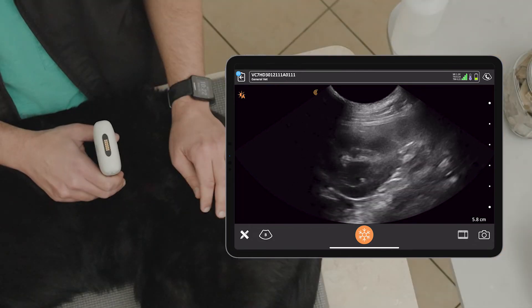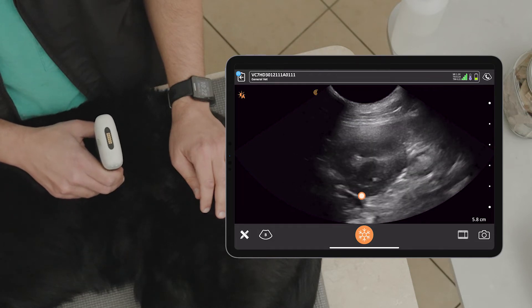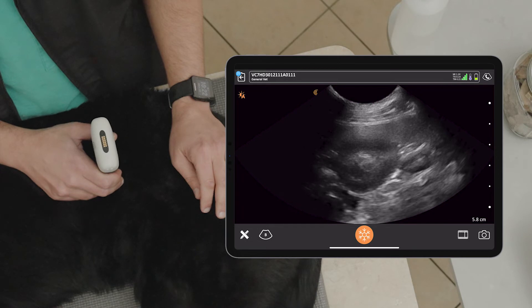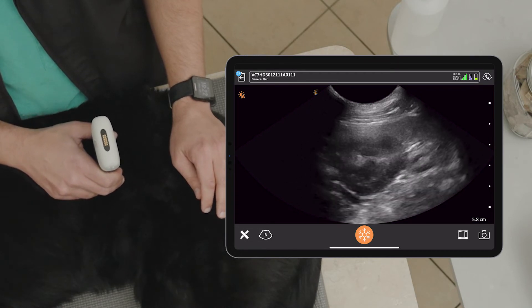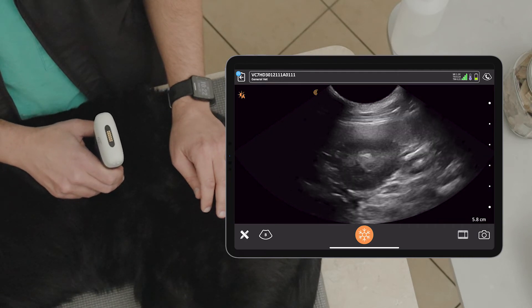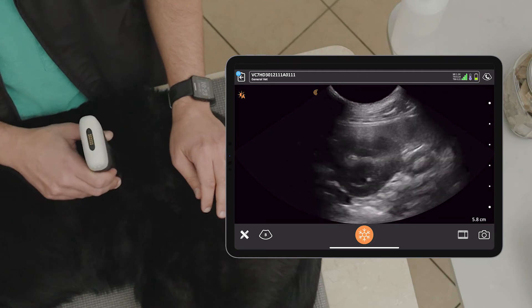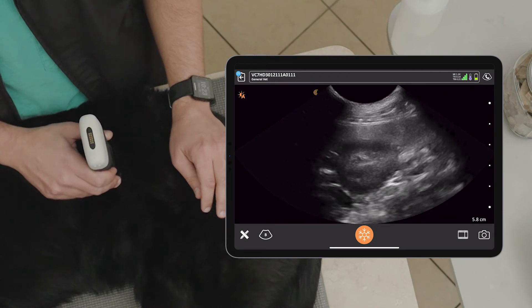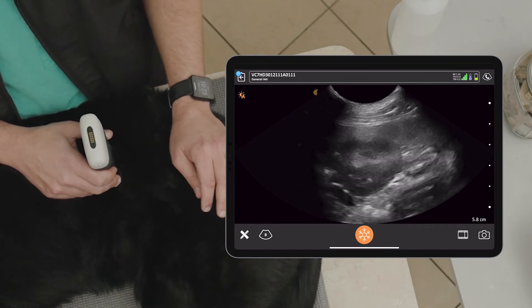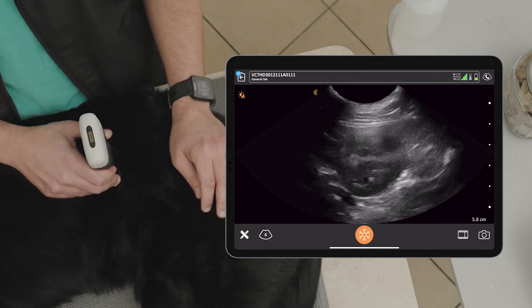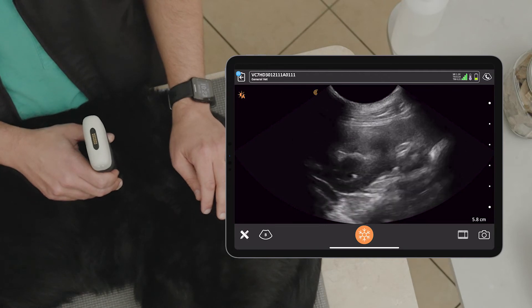And the final thing — Serge is in short axis. At this left paralumbar site, the left kidney usually tends to be a little bit easier for us to identify and assess that renal pelvis for dilation — again, more applicable in cats than in dogs. Serge has the short axis here, and he's just going to fan slowly back and forth until he can pick up that left renal pelvis in short axis. We're looking for that renal pelvis and that Pac-Man coming off it. In a normal cat or dog, it's pretty rare that we'll see any dilation, so it's not uncommon not to see that very clearly in our healthy patients.